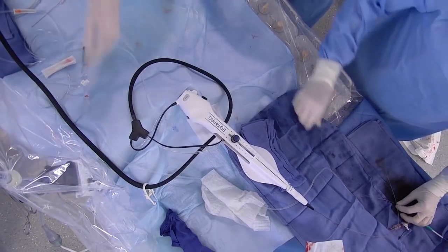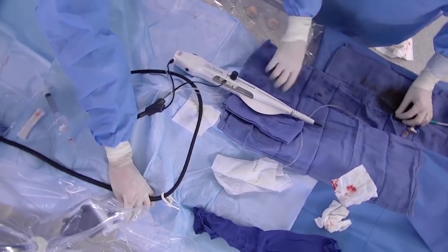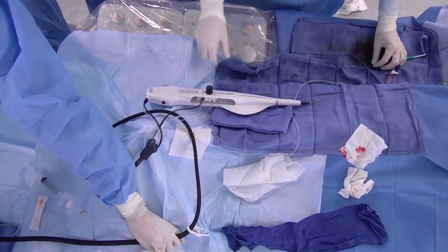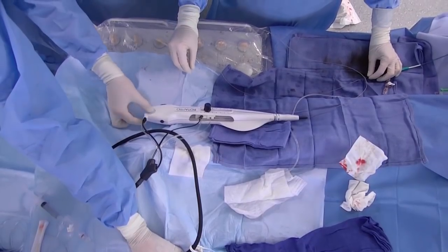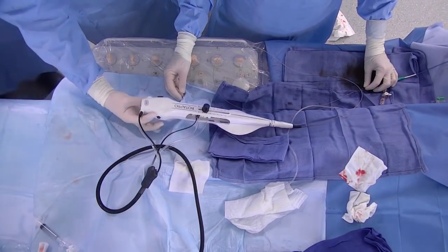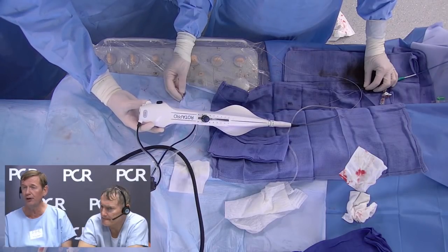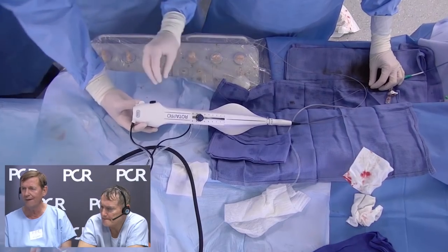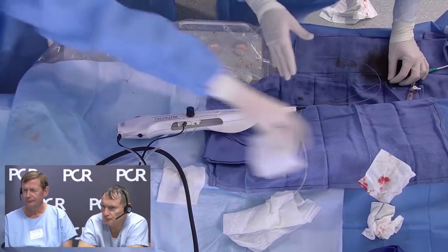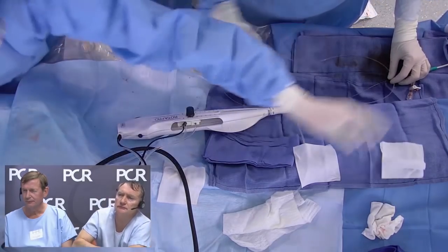I think they have questions from there. Please go ahead, Adam. There's a little space to park the brake in the back. They had it on the old system as well. Yes. Not everyone uses it, because sometimes it does cause a kink in the wire, which of course you need to avoid. But if you do it very carefully, it is quite convenient. So this is my technique, but we can discuss. A lot of people have different techniques.